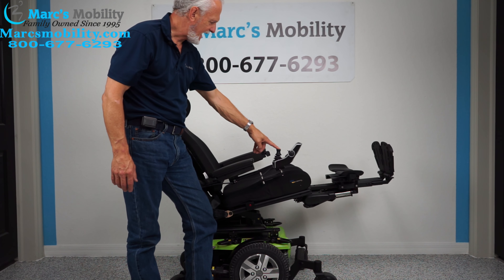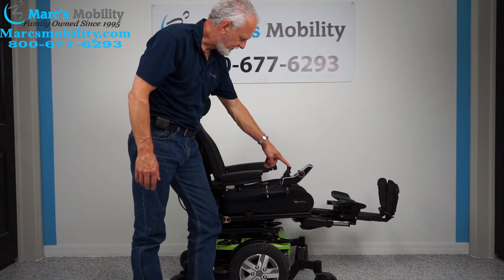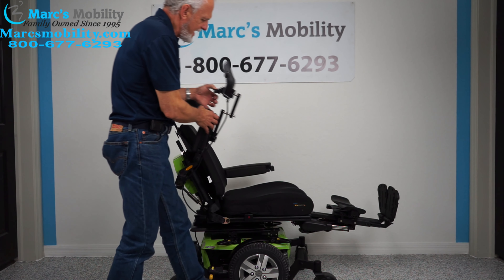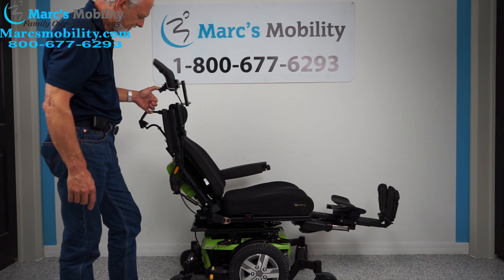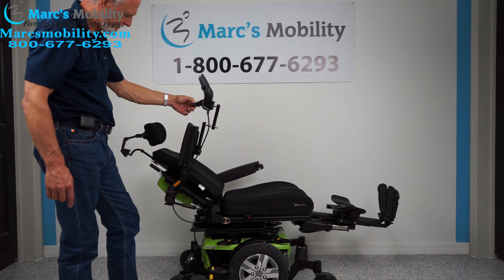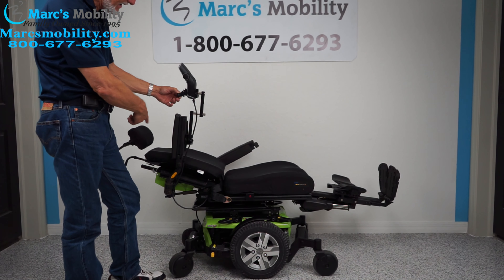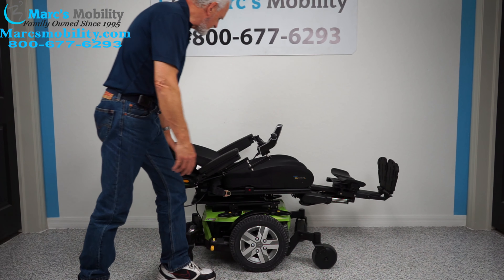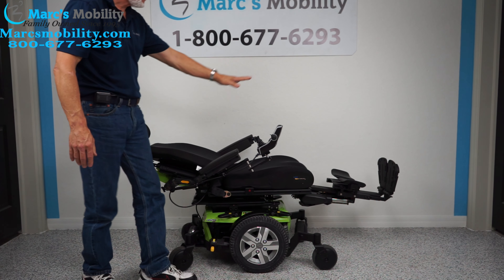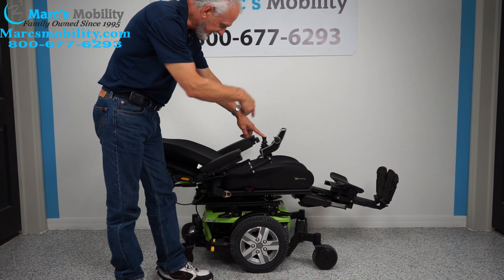I'm going to bring the seat back down to flat. The next thing I'm going to show you is the electric recline — that's when the back goes back by itself. If you watch the back right here, it's going back by itself. That little noise you hear, that's just the plastic on the back. So if you were laying down in this chair, this is what you would look like. The headrest would be adjusted to your head. This is the laying-down position of this chair. Now I'm going to bring the back up and the legs down all in one motion.